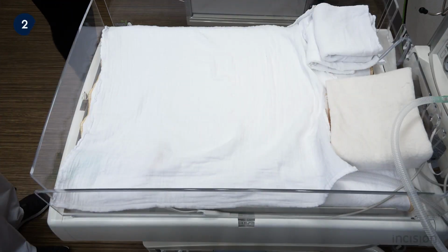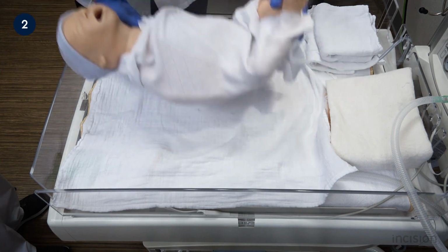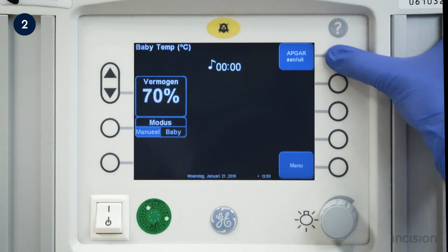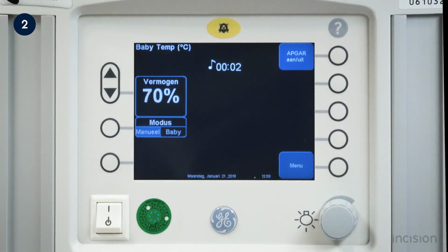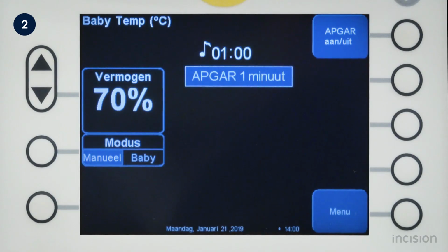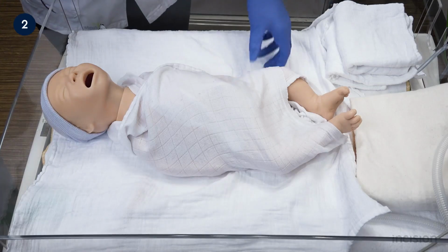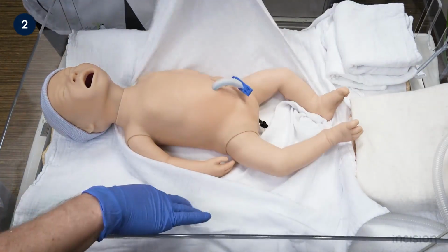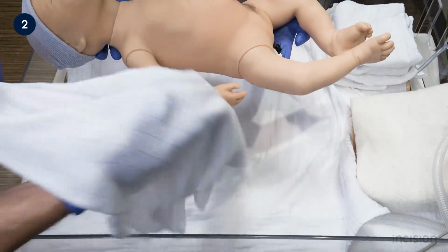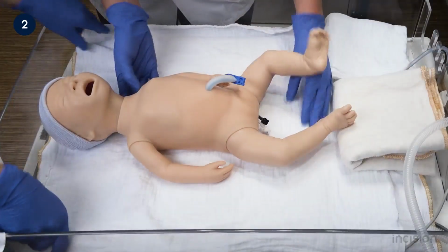If the newborn requires life support, it is taken to the newborn resuscitation table. The clock is started in order to time the resuscitation cycle. Time of birth is recorded, as is the APGAR score, at 1, 5, and 10 minutes. In order to maintain neonatal temperature, wet towels are removed. Avoiding neonatal hypothermia is extremely important for the condition of the neonate.